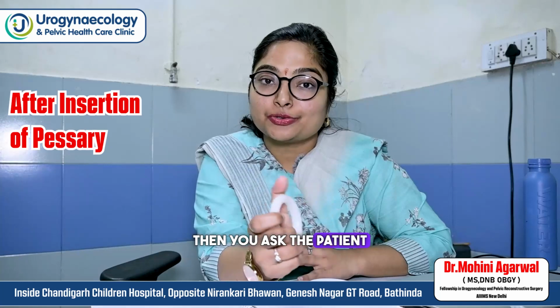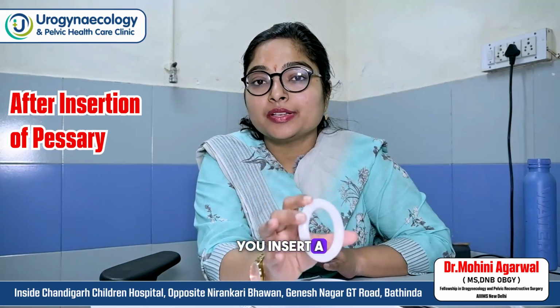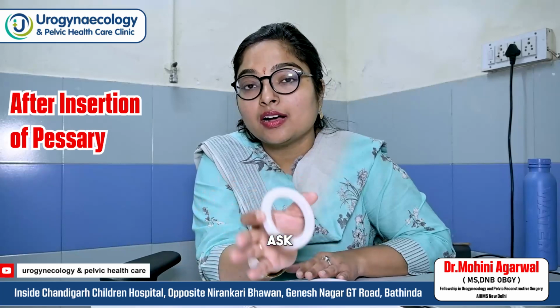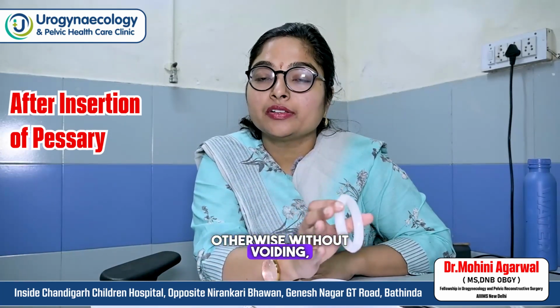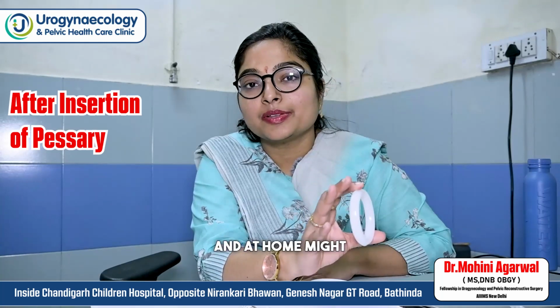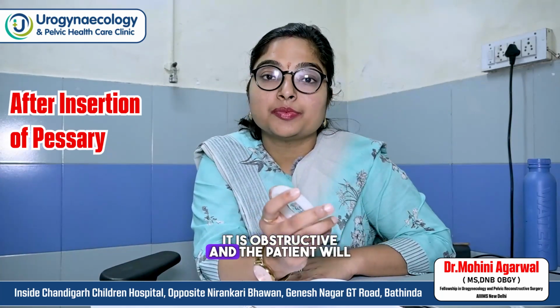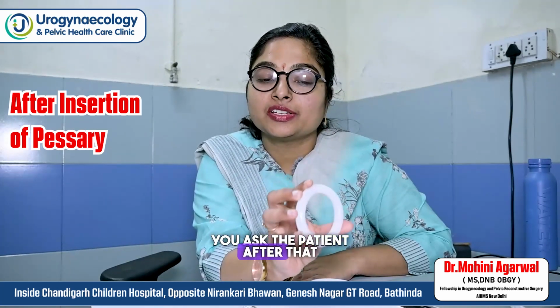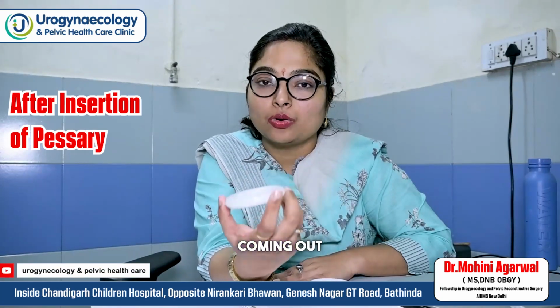Then you ask the patient to cough, to stand, to do Valsalva. Make sure that whenever you insert a pessary, the patient has voided. After you insert a pessary, ask the patient to void, and she should void comfortably. Otherwise, without a voiding trial, you send the patient home, and the size might be wrong or too large and obstructive, and the patient will not be able to void. So whenever you insert a pessary, you ask the patient to cough, to stand, to do Valsalva, to see whether it's coming out or not, and to void.